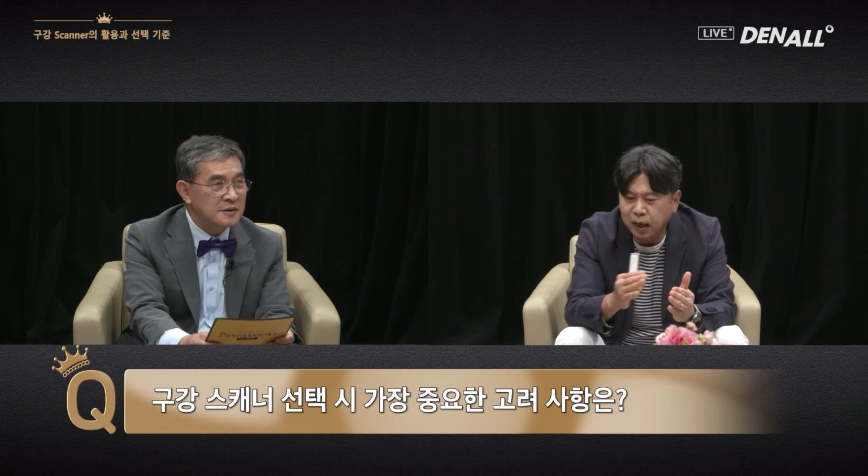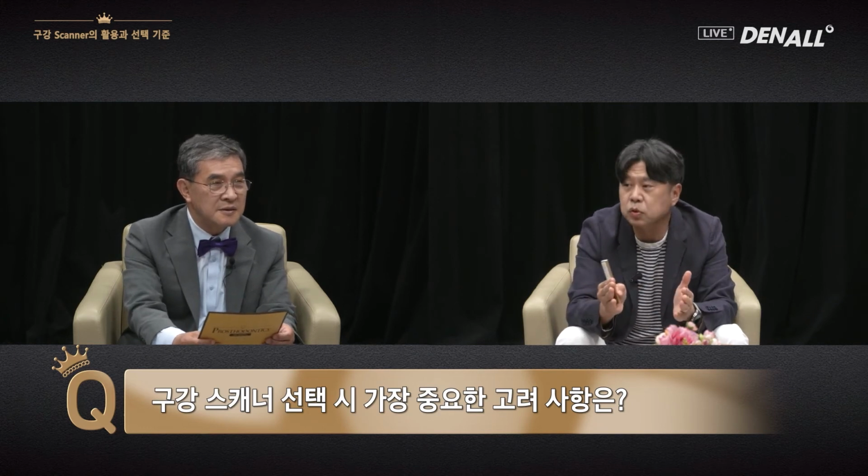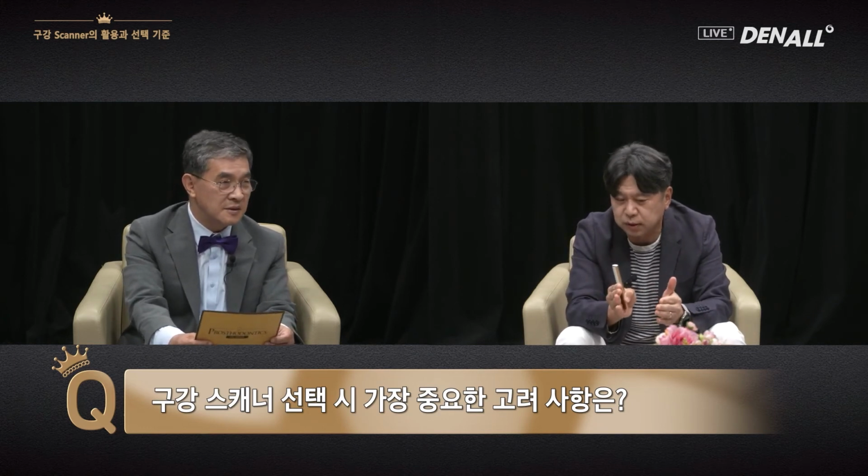When we try to adapt digital dentistry or not, we have to consider it carefully. We need to determine what we will do with the intraoral scanner. That is the most important thing. For example, if you want to use it for implant placement, or if you want to take impressions digitally, you heard that it would be very easy and accurate, then a certain type of scanner can be the candidates.